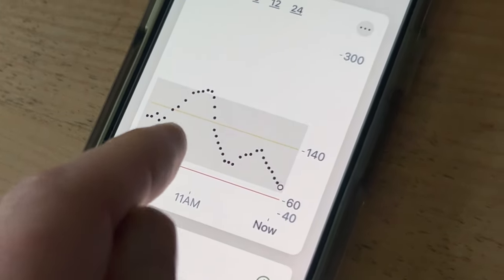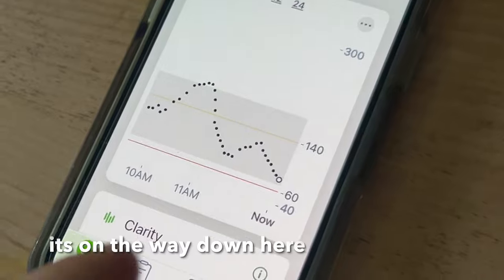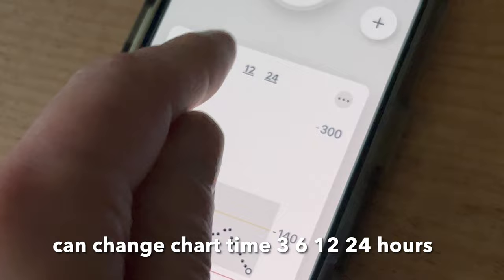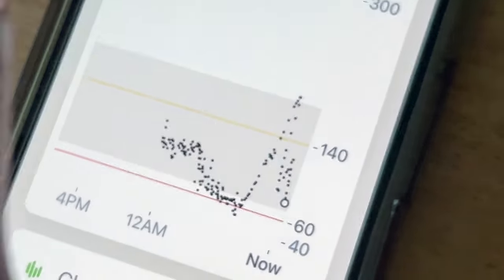Since 10 a.m. we saw a spike from eating something, and then it dropped in response to insulin, and then it's on the way down here. You can go like this and change the view from three hours to six, and the trend shows you overnight, and then 12 hours, and then 24 hours.